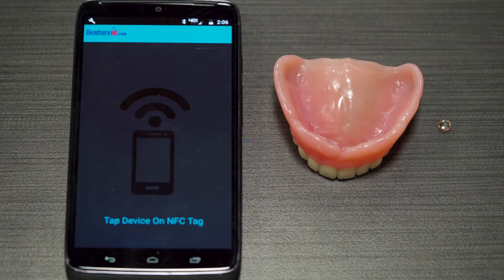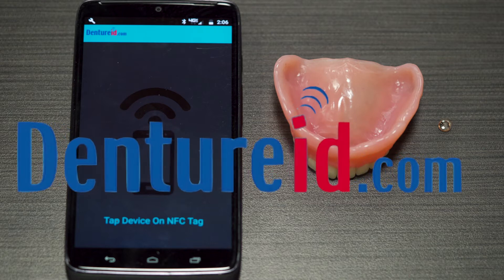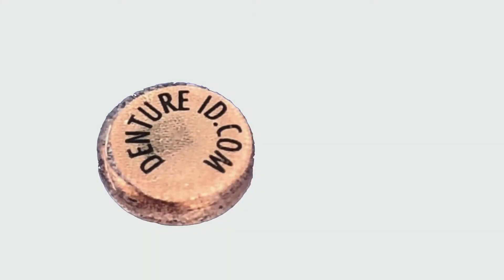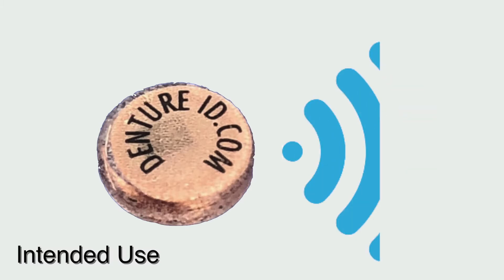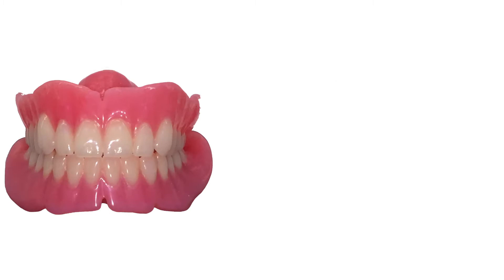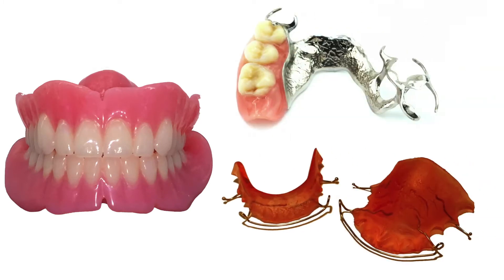This short video demonstrates the features and installation process for DentureID.com Microchip. DentureID Microchip is intended to enable access to secure patient identification and device information when used with complete dentures, partial dentures, and other removable oral appliances.